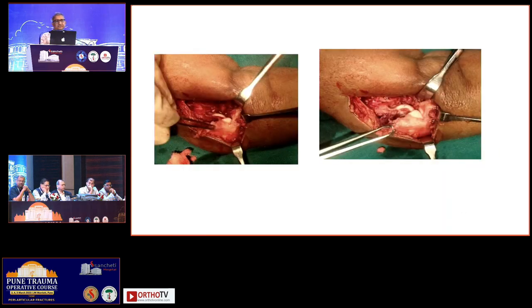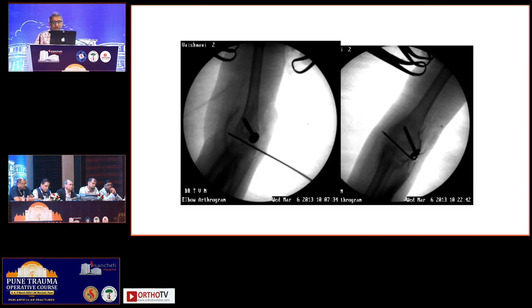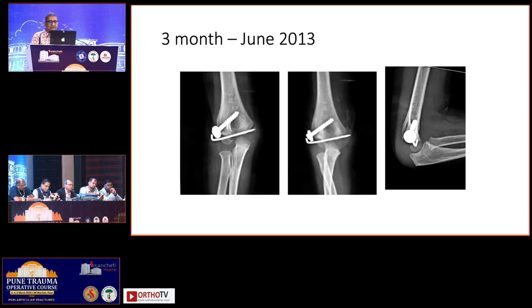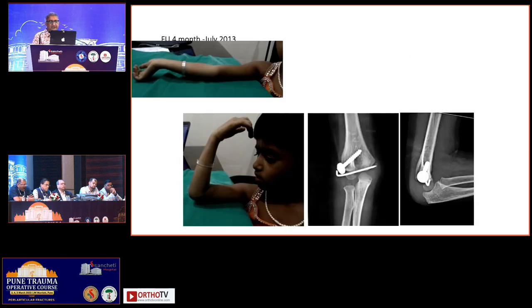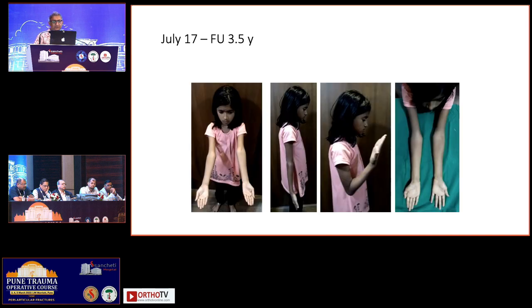Some of the pictures here show the exposure of the joint. Anterior exposure of the elbow joint is very important, otherwise you will not be able to get a good reduction. Again, this shows at the end of the screw fixation how the intra-articular portion of the elbow needs to be controlled. So here finally you have a screw and a wire, and the wire is removed first, and the screw is removed later on. And this is at 3.5 year follow-up. You can see good range of movement.